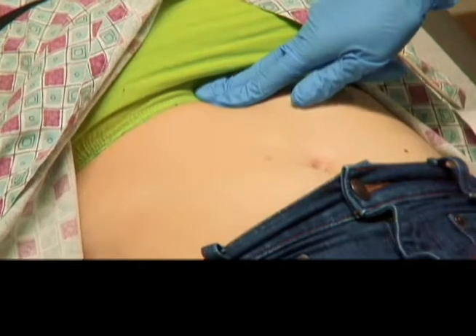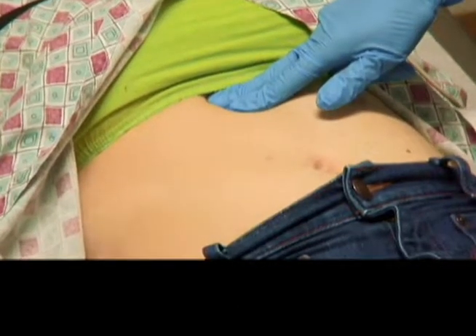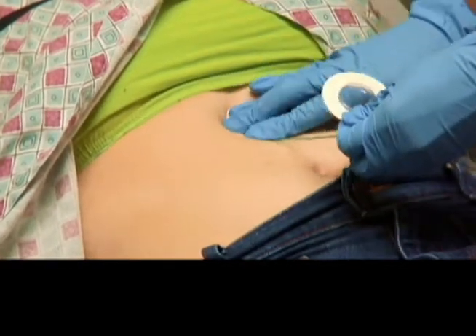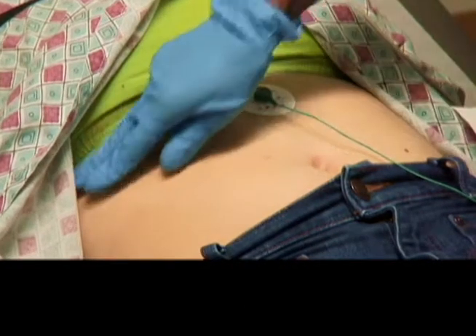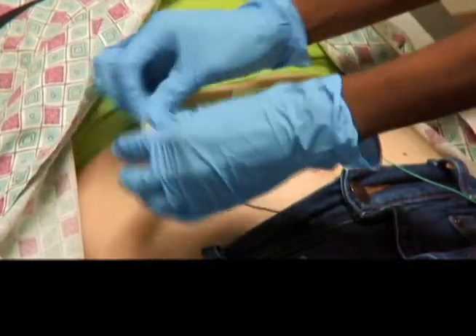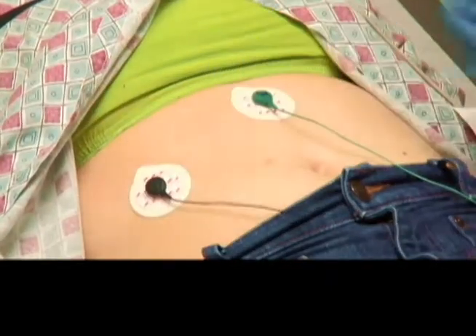We're going to look for our landmark, which is the xiphoid process here. We're going to measure about 2 finger lengths down, right above the belly button, and we're going to place the lead. Next we have the flap just below the last rib. You're going to feel for the rib here, 2 finger lengths down, and about mid-clavicle. Just like that.